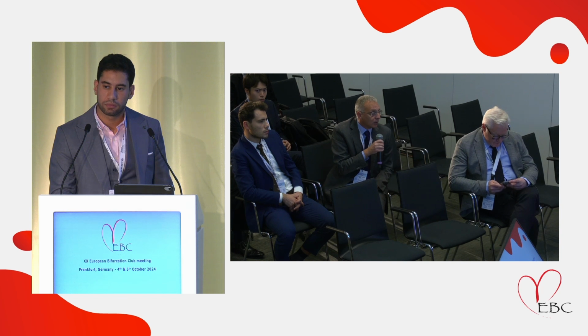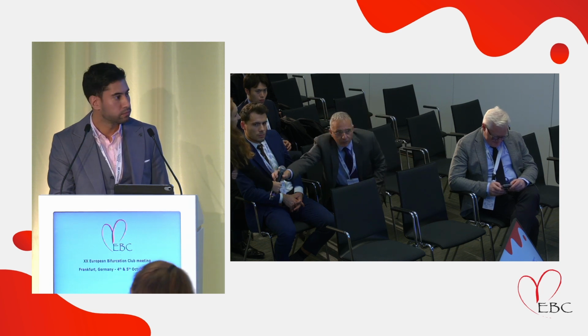Anyway, in this bench test, we applied the POT, and we know that there is the potential to let the stent become a little bit more round with the addition of it. And this is silicone, for sure. In humans, there is the possibility that the eccentricity in the expansion is related to the plaque presence. So you are true. Correct. So, quick question, quick answer.